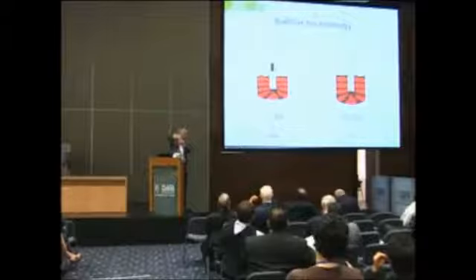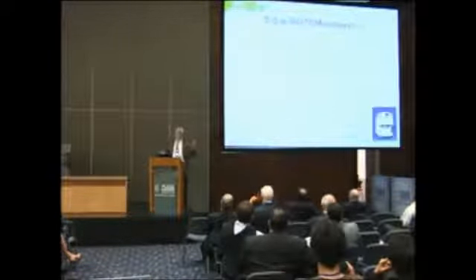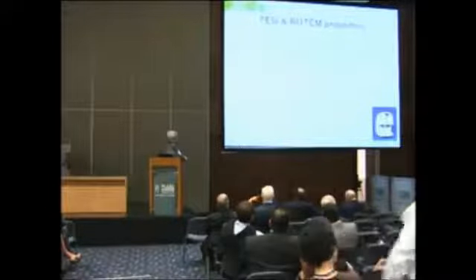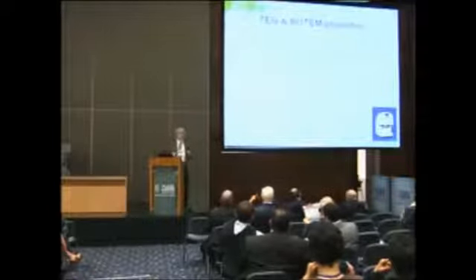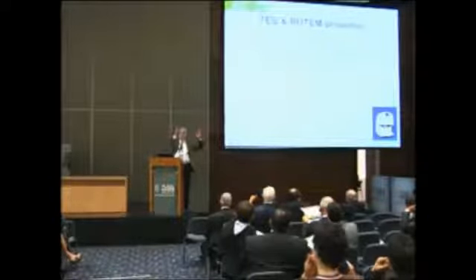And in one machine, the cup shakes. In the other machine, the pin shakes. See, a completely different test. And then as the liquid blood becomes harder, as a clot starts forming, you can see here there is no resistance on the pin. And then as the clot starts forming, you get this graph in here. So this here measures the resistance. So here's liquid blood, and here's a clot, that is the strength of the clot, how strong this clot is. And then here is how quickly this clot dissolves. So it shows the whole picture from the beginning of the clotting to the clot strength to lysis, to how quickly this clot goes. So it gives you a whole picture.